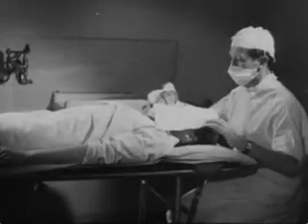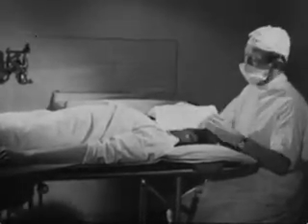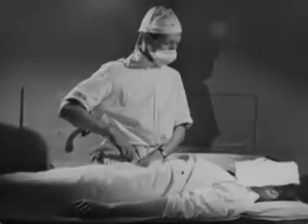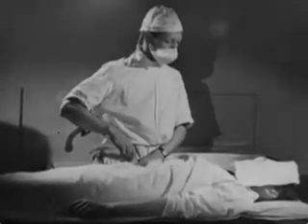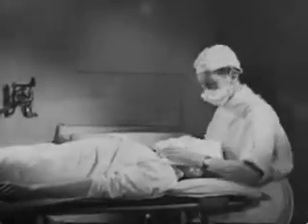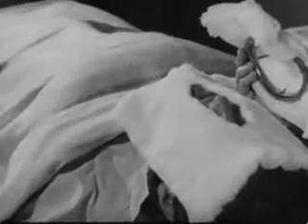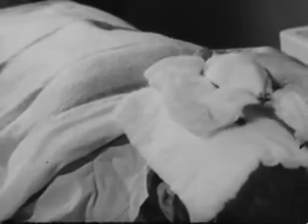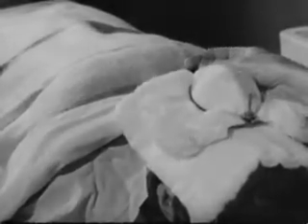If he becomes cyanosed, watch his pulse. Fortunately, breathing usually returns before the heart is affected. If the pulse weakens, you've got to get air into him somehow, by mouth-to-mouth insufflation if there's no other way. When the stridor's gone, you can continue cautiously with the ether.